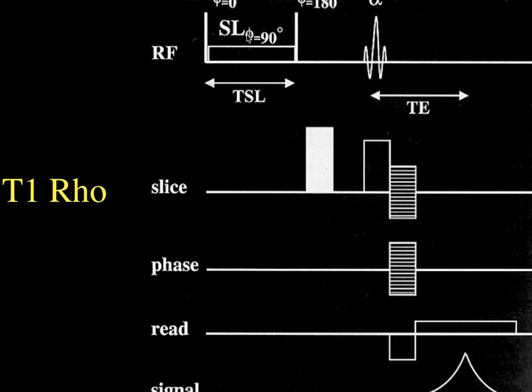And in fact, maybe beginning next year, we'll try to do some of these experiments with GE, looking at different ways to do T1-Rho and see which ones are more effective at looking at proteoglycan. It's not clear that it gives too much different than T2 in the articular cartilage right now, but there's a lot of interest in it.